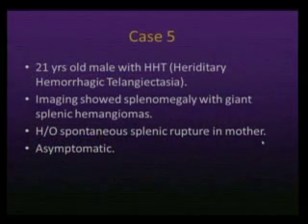Case 5. So these are all variations. When you think about splenic embolization, you think, oh, chemotherapy, ITP. There are different indications, different ways of doing things. When I was presenting at SIR, my thought was to bring in different types of cases for different indications. One of my colleagues was doing different ways to embolize. So I don't have his cases, but the theme was different indications. Just to broaden that, we don't embolize for one thing, you can do this for a lot of procedures.